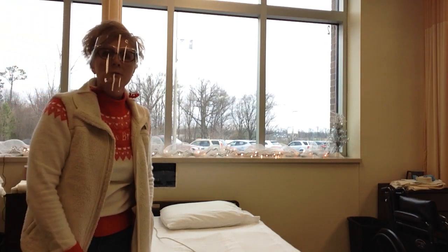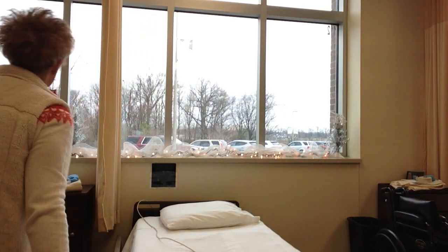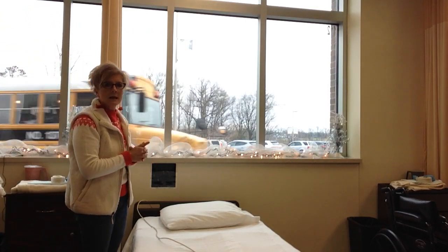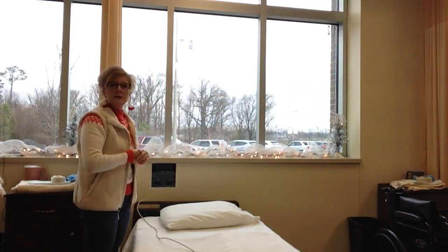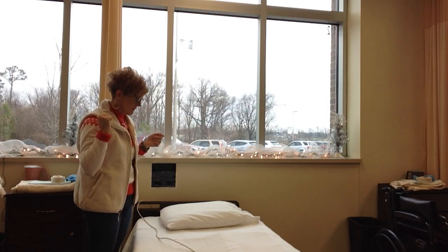Alright guys, page 22 of your skill book — this is unoccupied bed making. I'm going to knock, enter. Hello, my name is Monica Hall, your nursing assistant today. Our resident is sitting over in the chair. We are here to change your bed. We're going to wash our hands and provide for privacy.